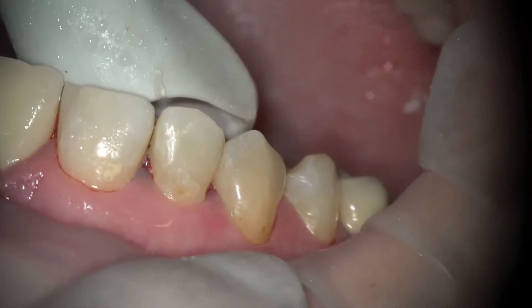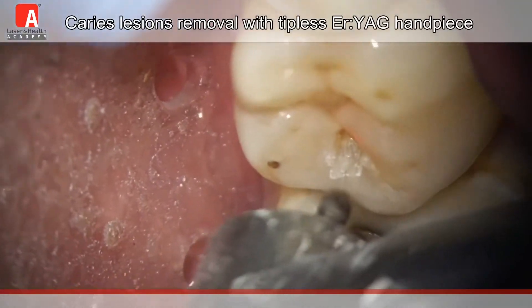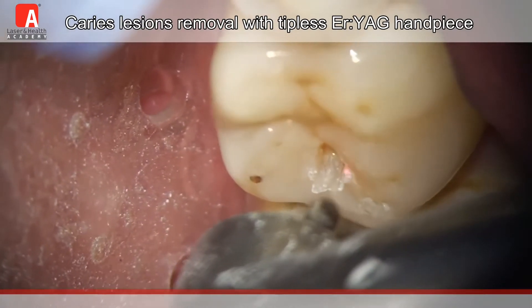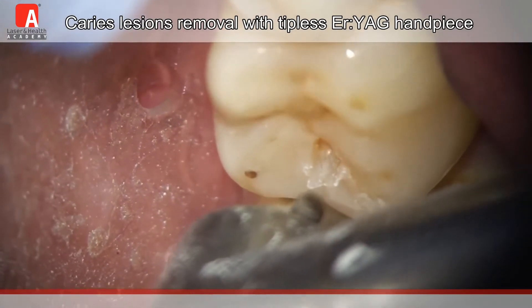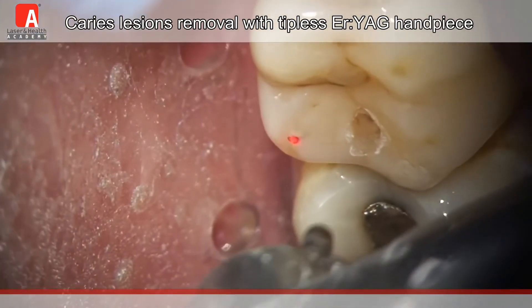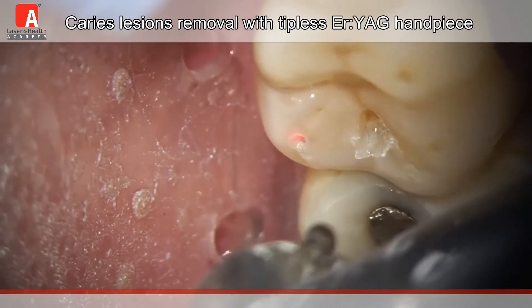Taking a look at the biting surface of a molar, which has multiple smaller lesions all over it. You can see here that the laser is being used to selectively remove decayed tooth structure from the larger part. And now, moving on to the smaller cavity on the same tooth, the decayed tooth structure is being selectively removed while the healthy tooth structure is being preserved.